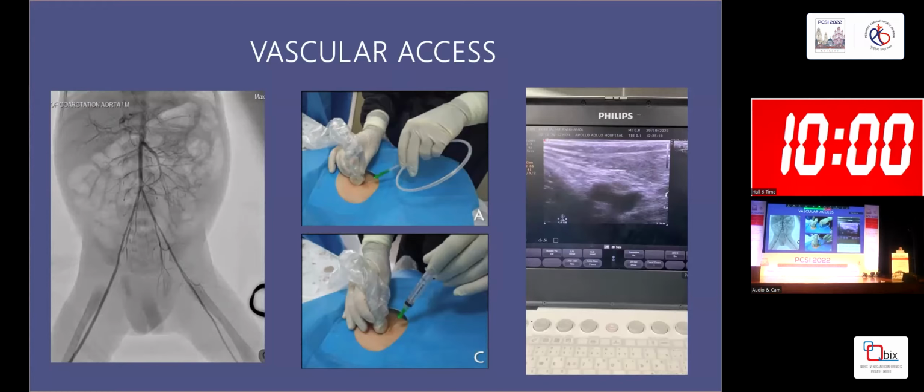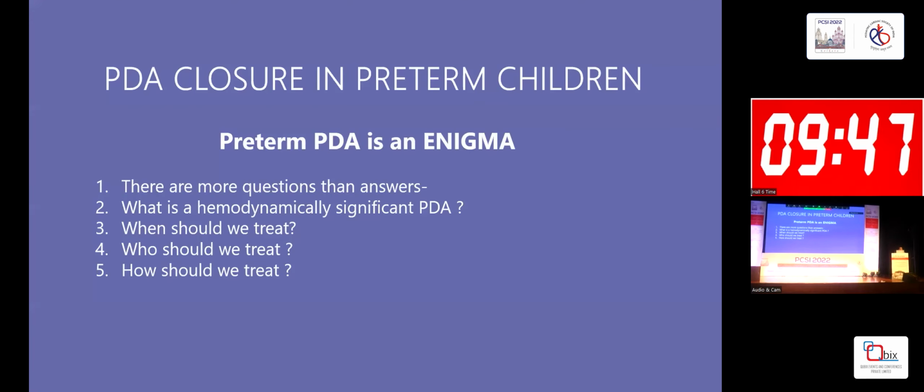The vasculature goes into vasospasm immediately after 2 to 3 punctures. So getting the access with the initial prick itself is very, very important. It saves time. Let me go through a few procedures which I've done.